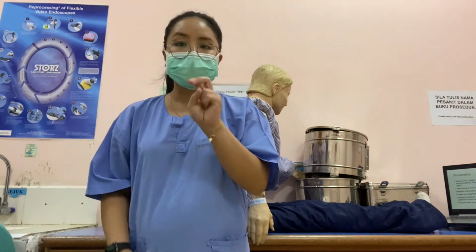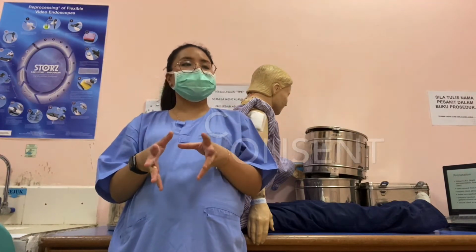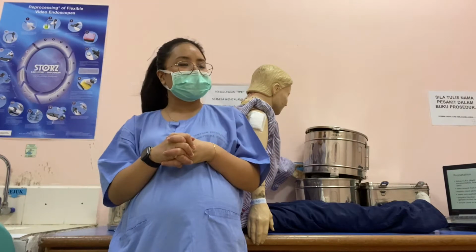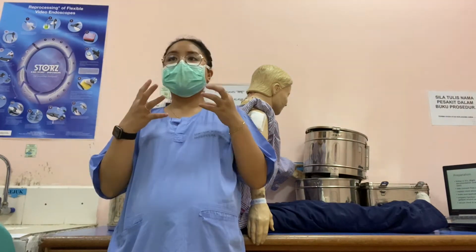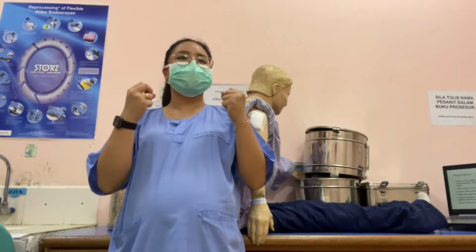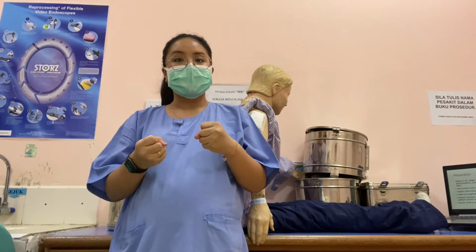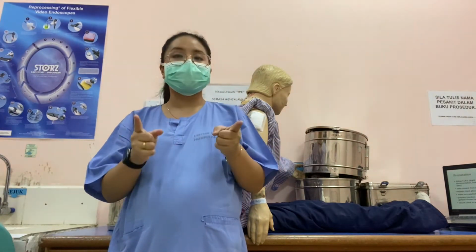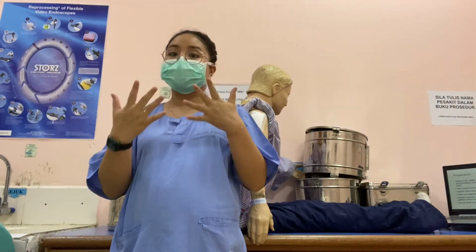Number two, you must take consent from the client. Does he or she agree for that procedure to be undergone?